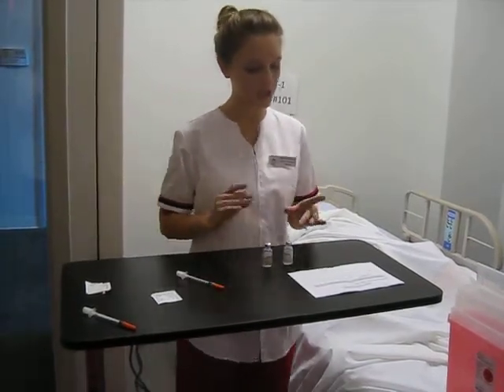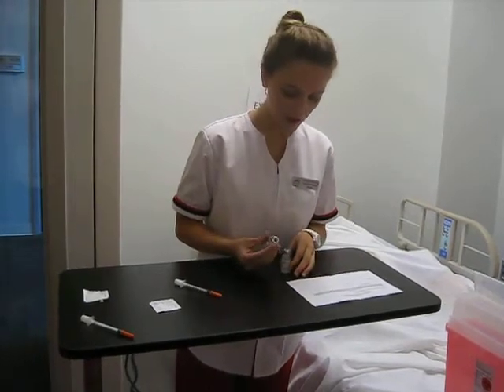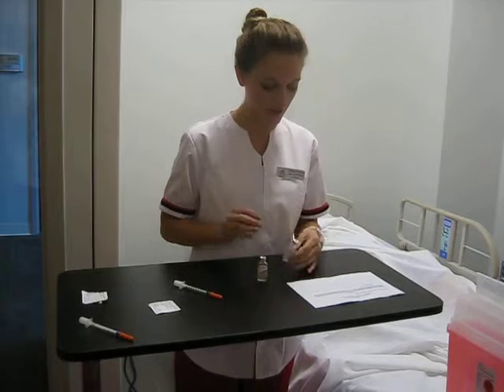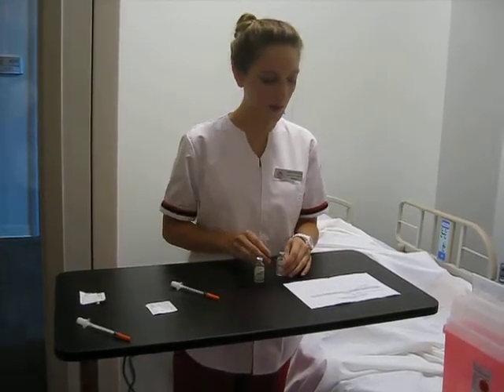I need to make sure everything matches up with the MAR. I do have my regular insulin — we will need six units of this — and my NPH — we will need 22 units of this. I'm going to go ahead and roll my NPH.